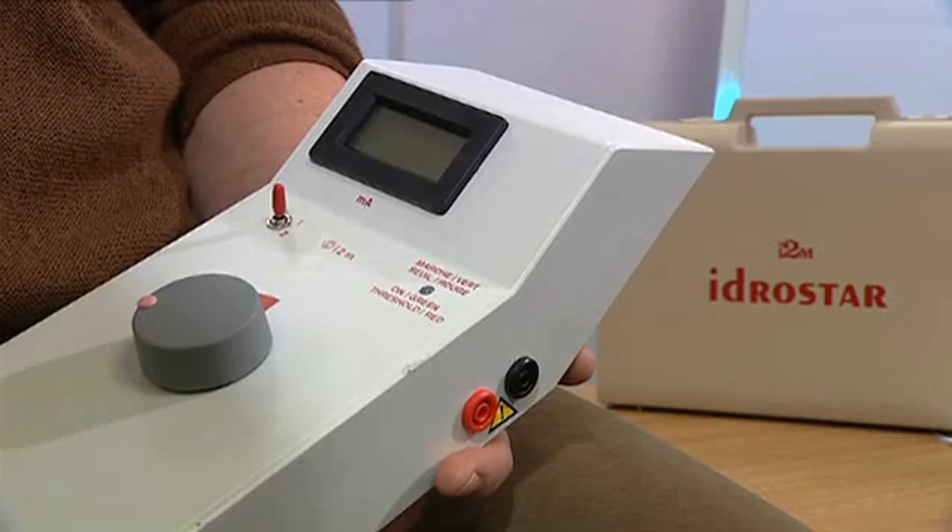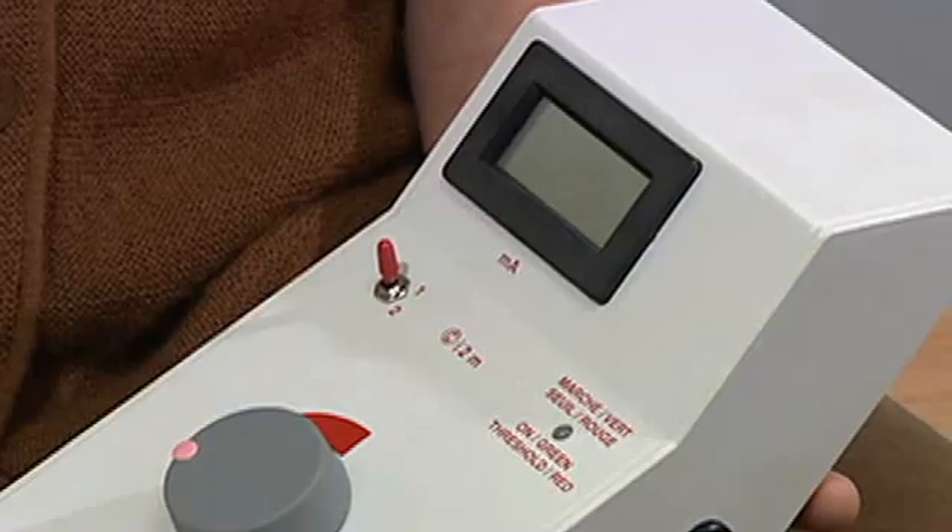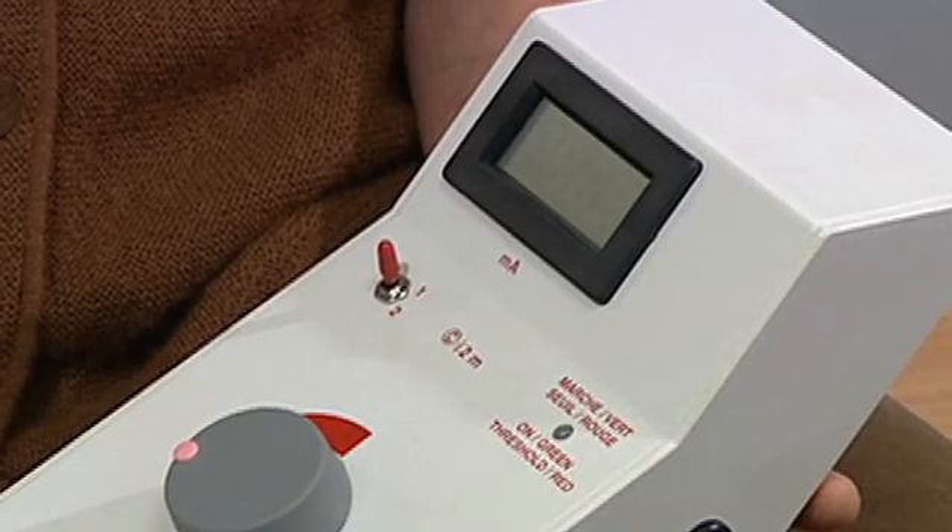Hello. The Idrastar machine that you have bought is for the treatment of hyperhidrosis of the hands and the feet. It should not be used if you are either pregnant, have a cardiac pacemaker or similar device fitted, or you have any metal orthopaedic implants.